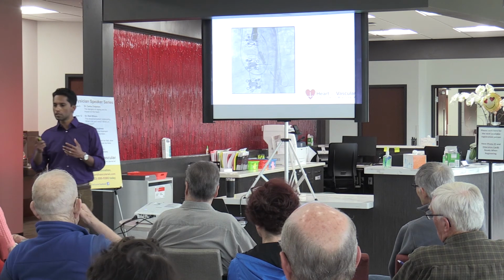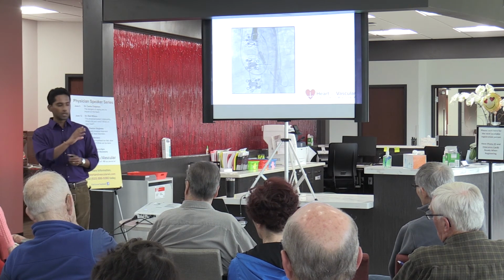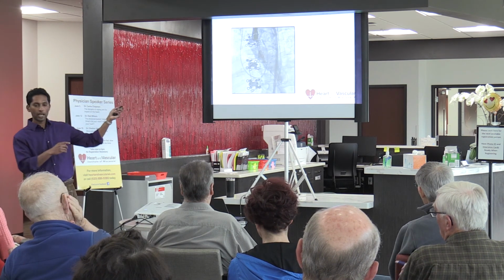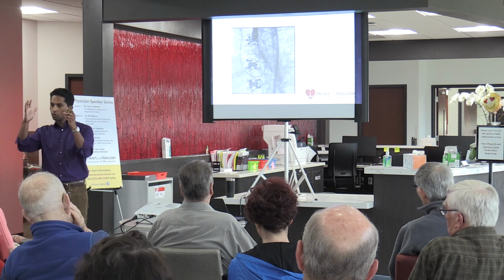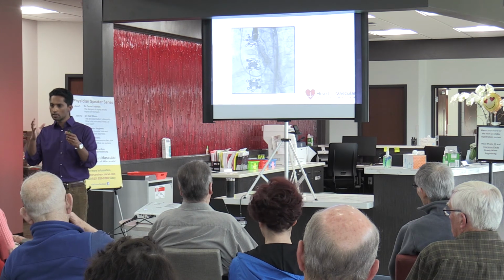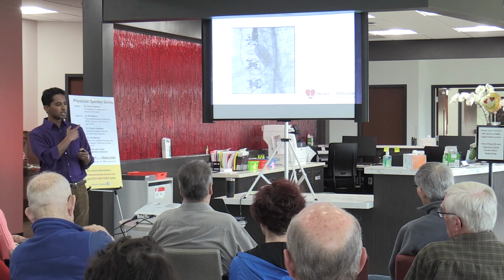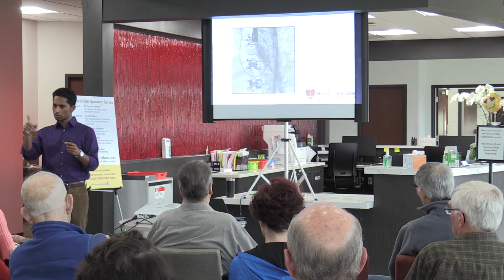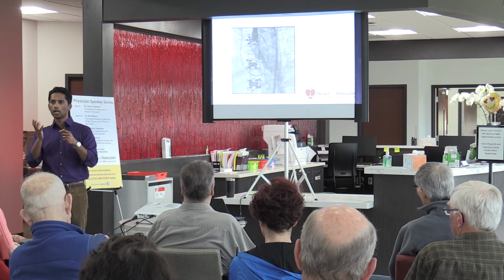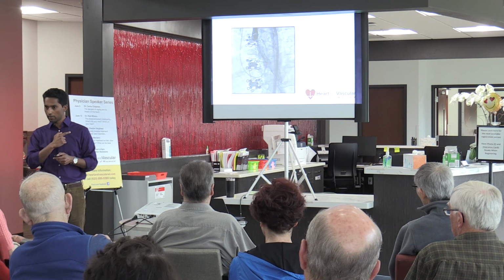The other problem with mitral regurgitation is that it sits in a place that's very different from the aortic valve. The aortic valve sits in the aorta, which is essentially a tube, so it's a somewhat convenient place to deploy this kind of valve. The mitral valve sits in a very different structure, a bigger, oval space, which is a much more challenging area to try and deploy this kind of valve.